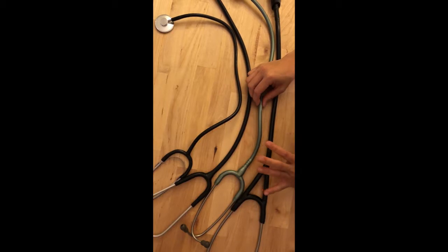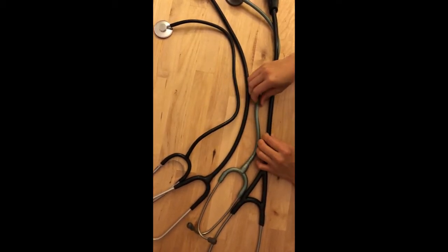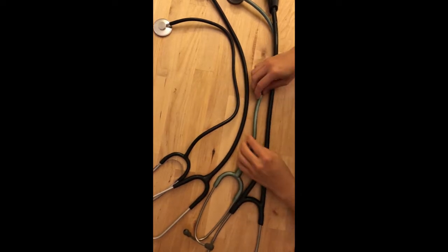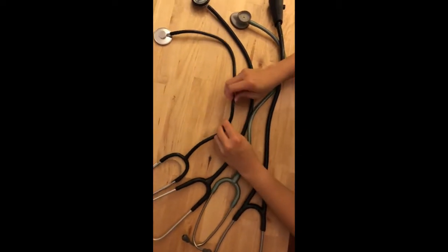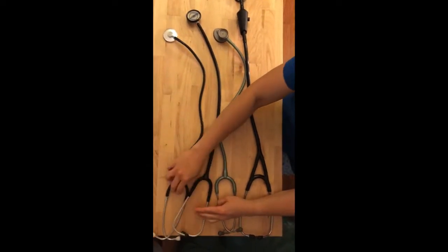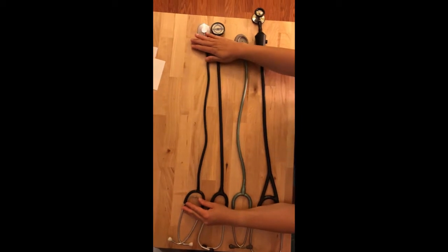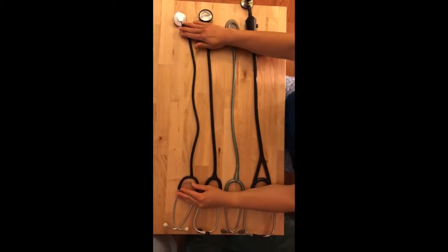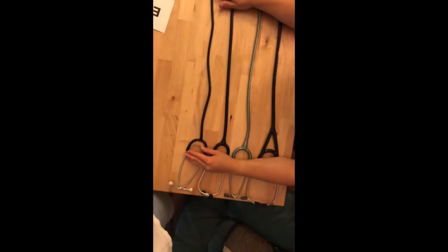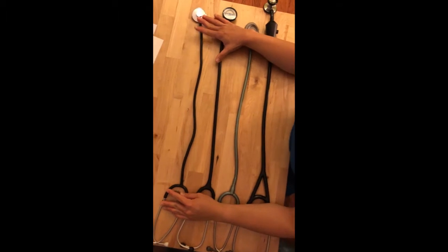For tubing, diameter-wise and firmness-wise it's the Echo Core, but if you prefer soft tubing, Littmann is a good choice. All of them are flexible. In terms of length, comparing them side by side, the Echo Core is the longest. The Littmann Lightweight is the shortest, the Rely On is second longest, and the ordinary stethoscope is in between.